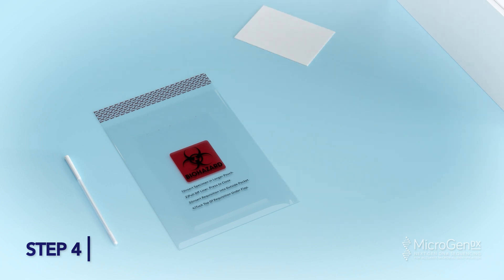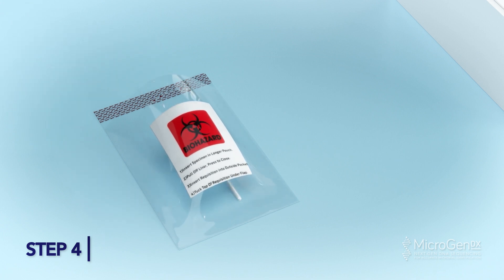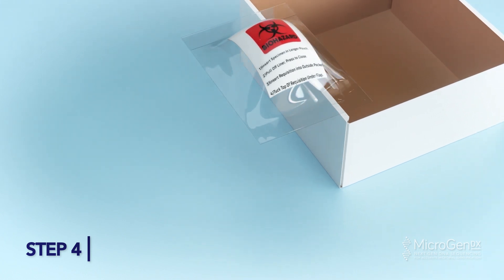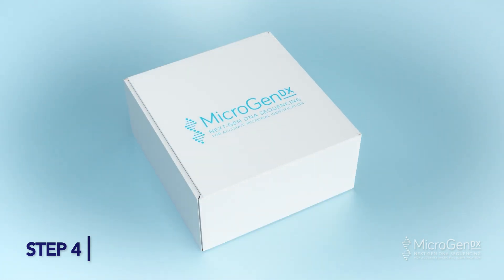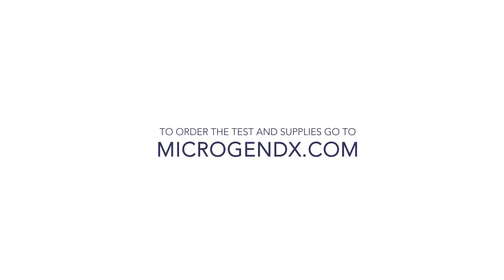Place the oral swab tube into the larger pocket. Peel off the strip and press to seal the bag. Place the sealed bio bag into the Microgen DX prepaid shipping box and send out according to your facility protocol. Alternatively, take it to the nearest FedEx dropbox.